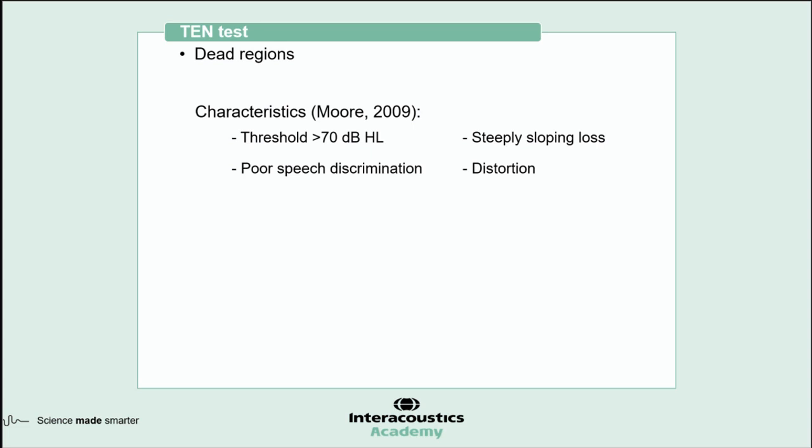Yeah, and I think that's what Dave is making a reference to there. He's making a follow-up with that, saying that it's his impression that it's something that's probably overlooked very often. Yeah, I think so. Absolutely. I think a lot of people assume dead regions appear at about 100 dBHL, and that if you're recording a threshold or something is not recordable there, then they can't hear anything at that point.